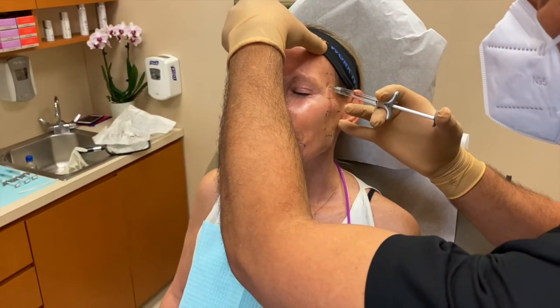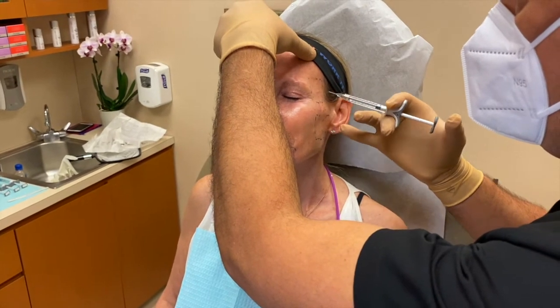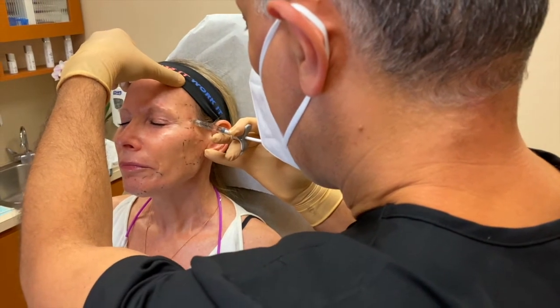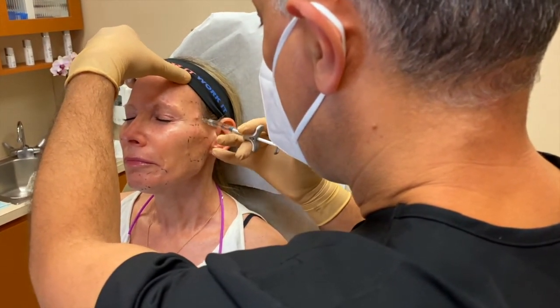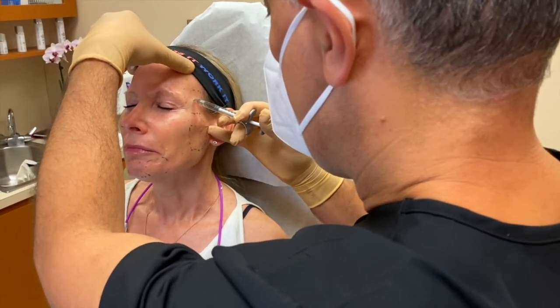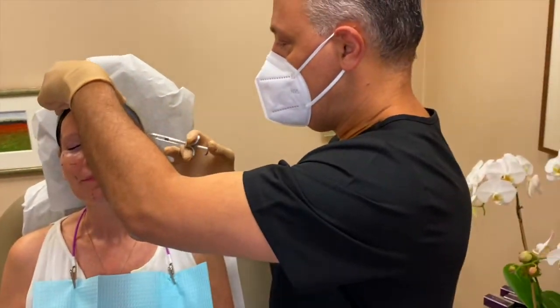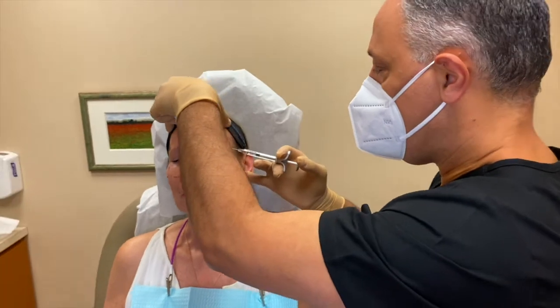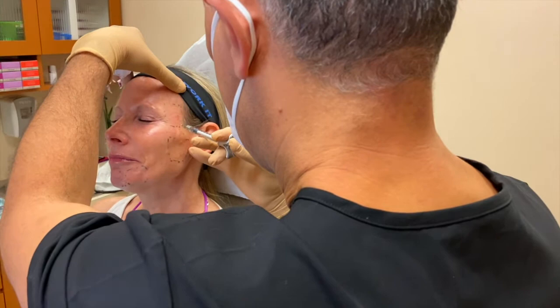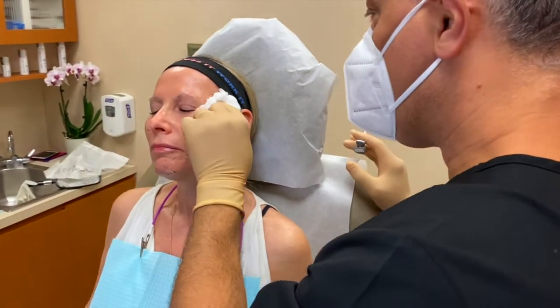Deep breath. Good job, Adrian. I'm just kind of injecting very slowly. There is a numbing agent in this filler, so in about a minute or so, Adrian, you are going to feel a little bit numb. Good job, Adrian. Beautiful. Okay. Love your smile. Here we go, okay? Just injecting a little bit at a time. So that was one syringe.